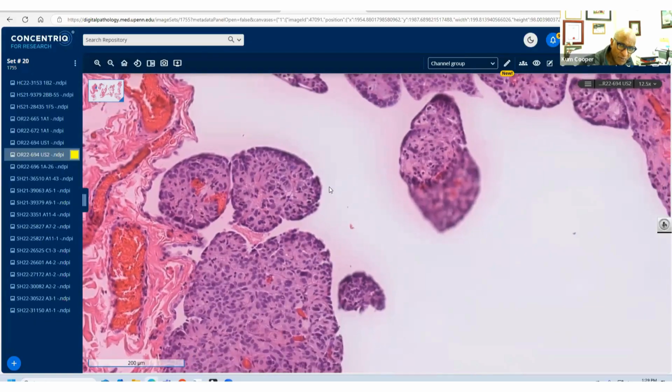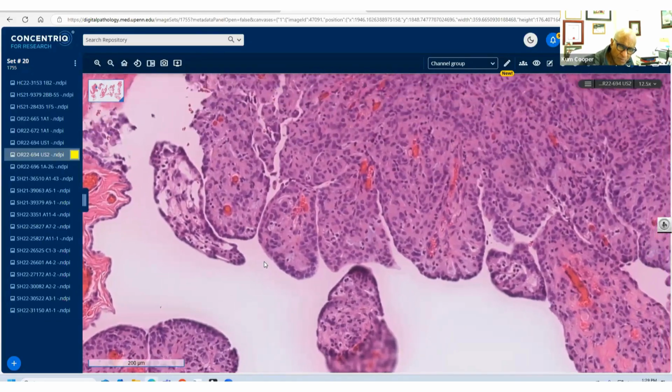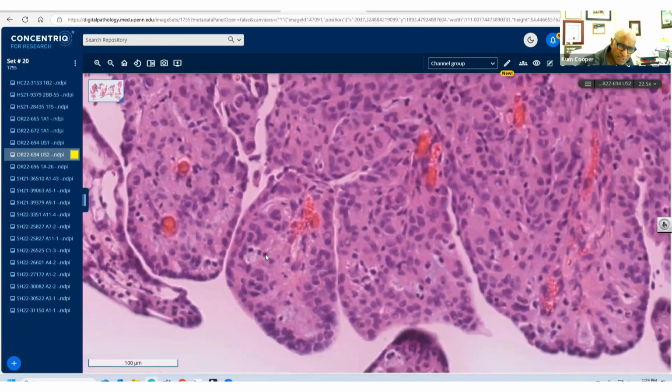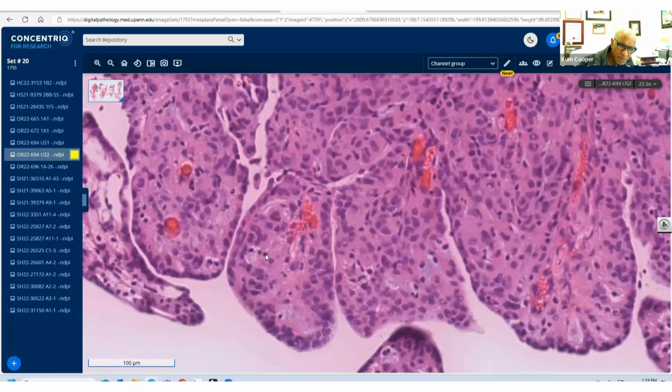But I was thinking of BAP1, BRCA-associated protein, and that's lost in a subset of mesothelial malignancies by I think it's about 60%, again, similar to H3 we just talked about. So it's lost in about 60% BAP1. There is another marker, MTAP, which we don't have, so I can't comment on that.